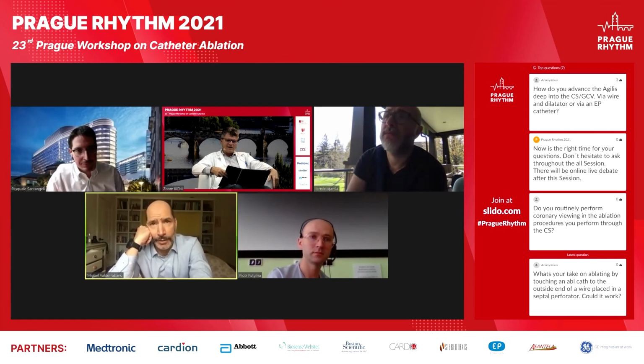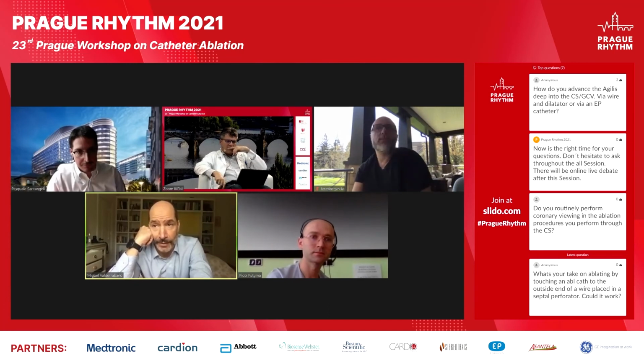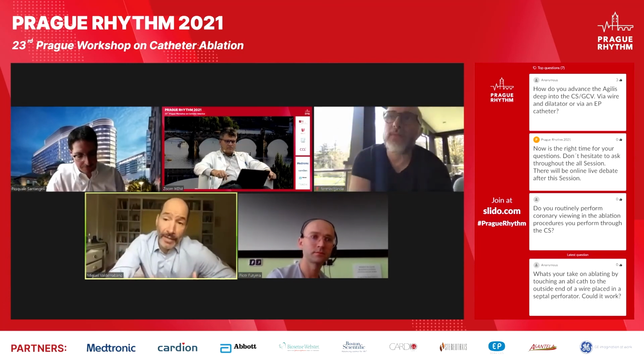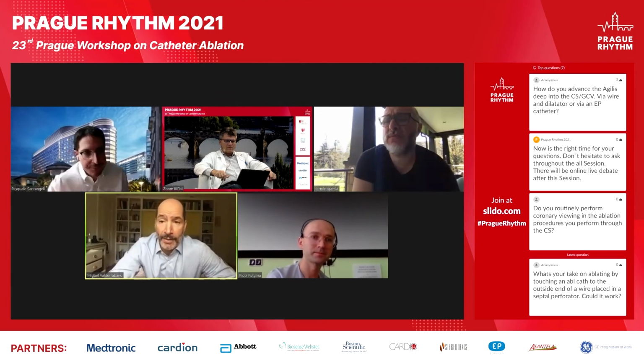Do you have data? Let me just say one thing. I share the concern that you have, and we are gathering data on the size of the ablation by MRI. Currently, there's no data on MRI on multiple ablations by RF, on RV endo, LV epi, AIV. So I don't have a standard of care to compare it with. But I will gather the data and I'll show it to you, and then you can make your judgment.